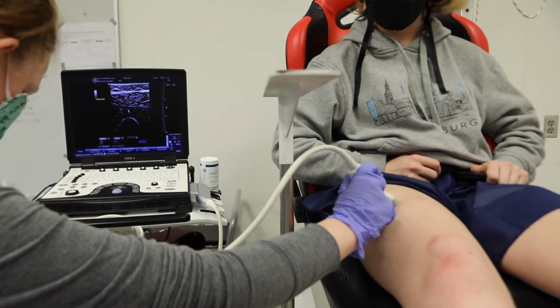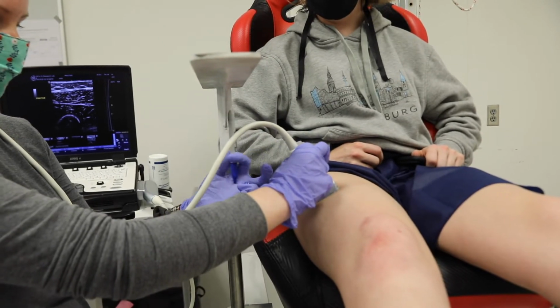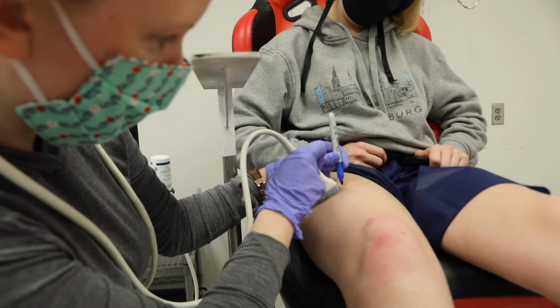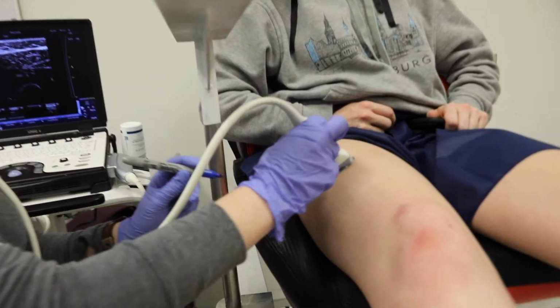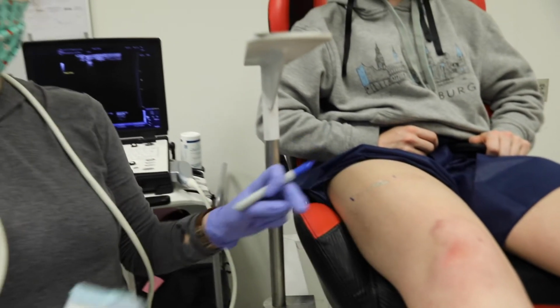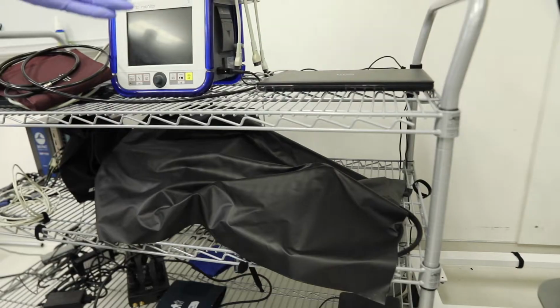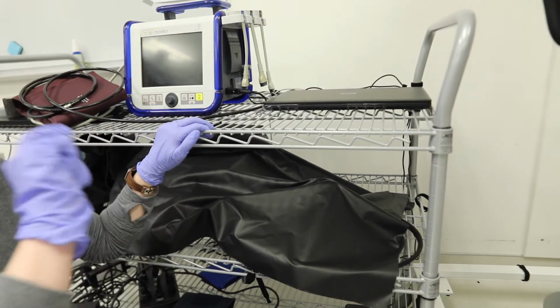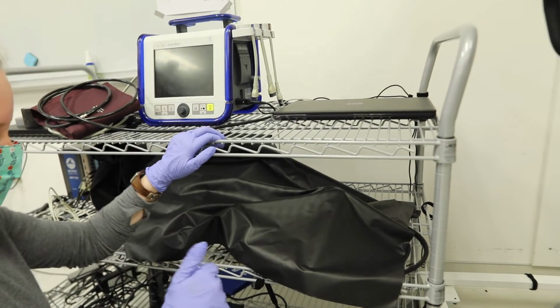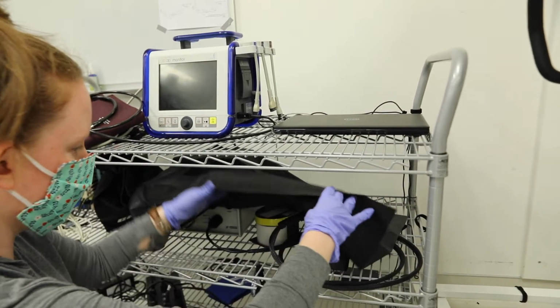And then before we let go, we want to make sure to mark it with a Sharpie. You don't need a huge mark. I usually just do a dot or a line on either side of the probe, so that when I take it off, I know exactly where it is, so that the NIRS can go right in the middle of those two marks. Once you've found the vastus lateralis on the subject's leg, you can also use that measurement on the ultrasound to measure skin thickness.